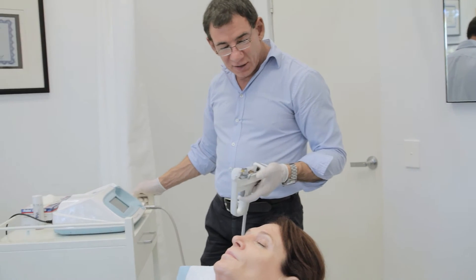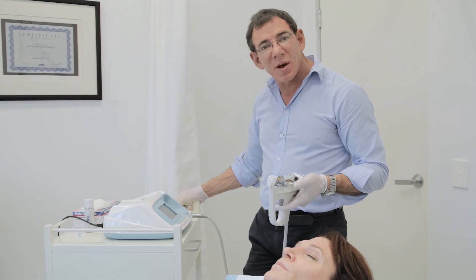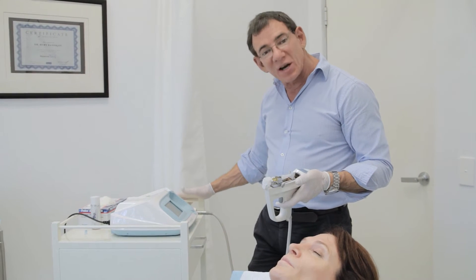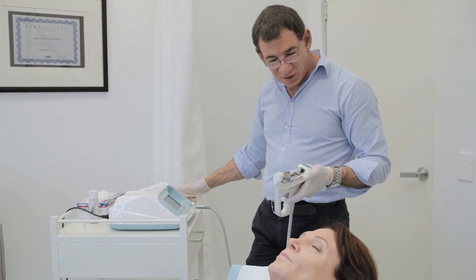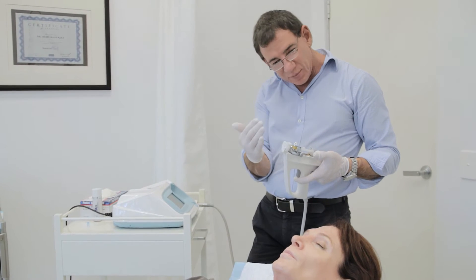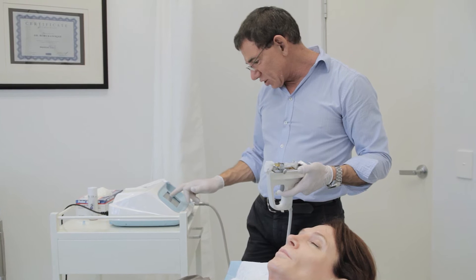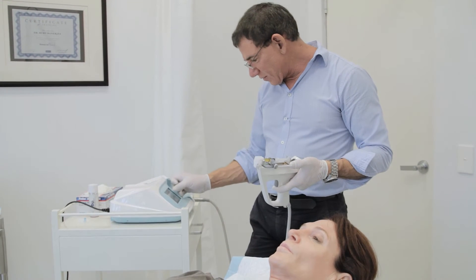We're doing the scalp now and we're injecting platelet-rich plasma. In this situation we want to inject it down in amongst the bulb of the hair follicles, which are at least five millimetres down. With this injecting device we can gauge the depth — we can set the depth of injection from about half a millimetre to five millimetres, so we're using the maximum depth of five millimetres. This gun produces suction to pull the skin up, but there's no point doing that on the scalp because the hair will stop that. So we're turning the suction off and injecting reasonably large doses of PRP with each pass, trying to flood the hair follicles with PRP.